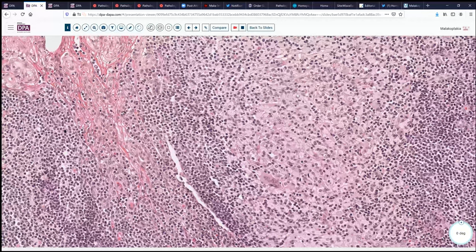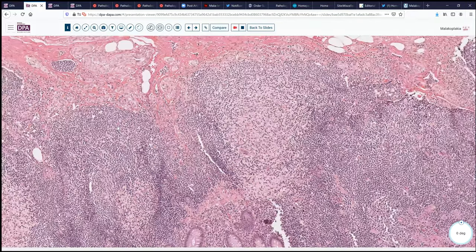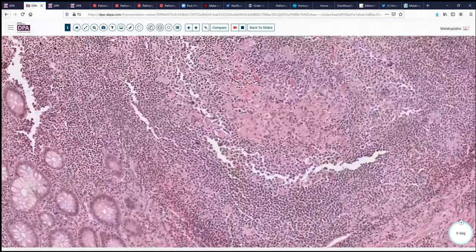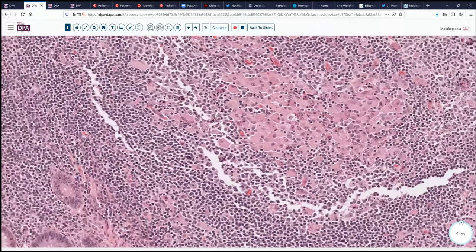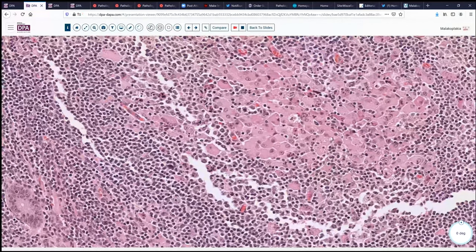As Dr. Compton used to say, whenever two or three histiocytes go walking, that's a granuloma. So this might fit into the category of granulomatous disease. And looking at this other area, we start to get a little suggestion of something maybe a little bit funny — some sort of dark blue dots in the cytoplasm of some of these histiocytes, little inclusion-like structures. We'll think about that for a minute.